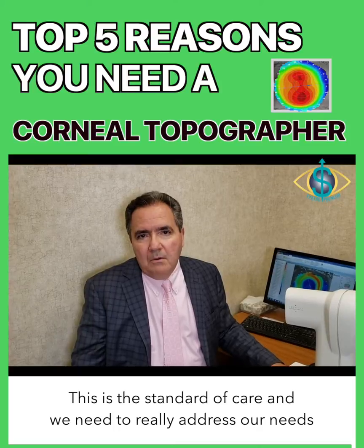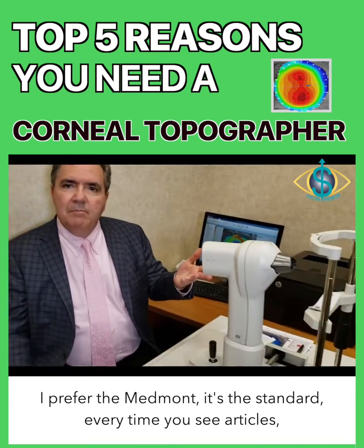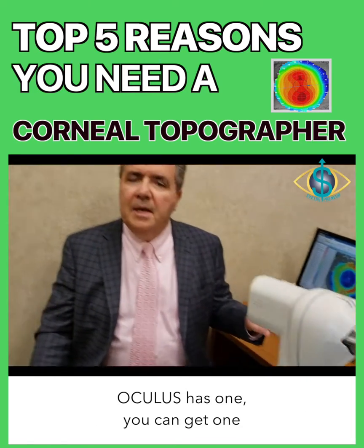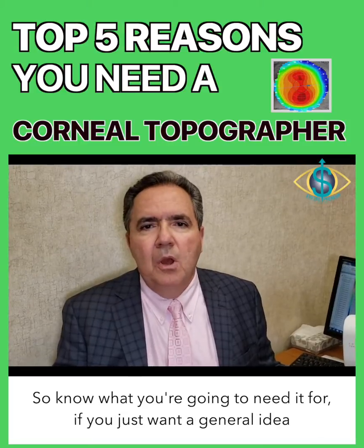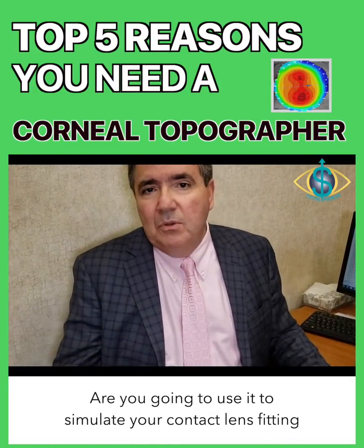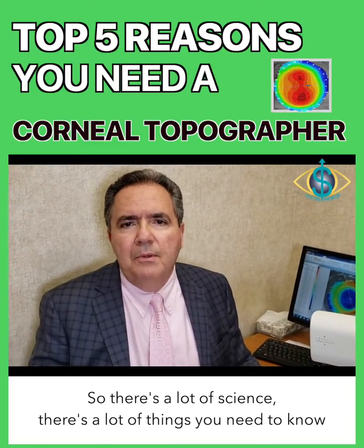This is the standard of care, and we need to really address our needs to do a good job for the patient. Now, there's different types of topographers. I prefer the Medmont. It's a standard. Every time you see articles, generally speaking, they're showing the Medmont topographer. Oculus has one. You can get one that's attached to your Topcon autorefractor. So know what you're going to need it for. Do you just want a general idea, or are you going to use it to design contact lenses? Are you going to use it to simulate your contact lens fitting on the monitor before you even try lenses on?